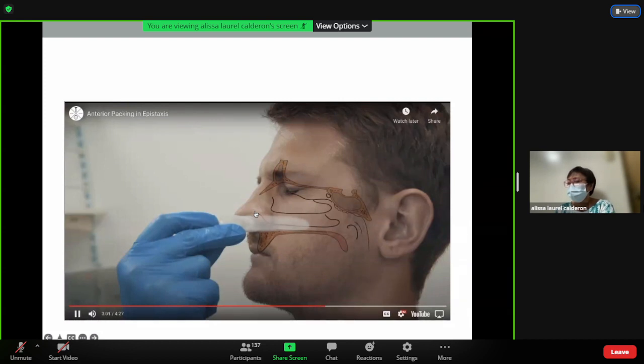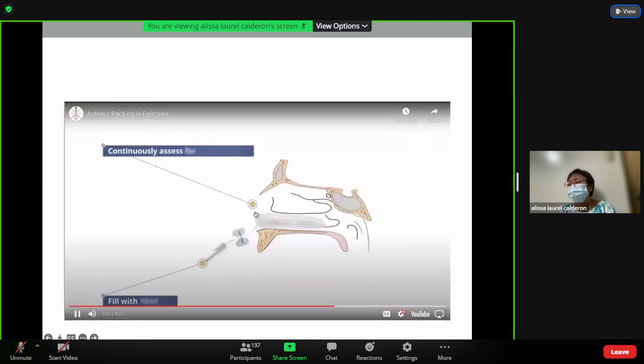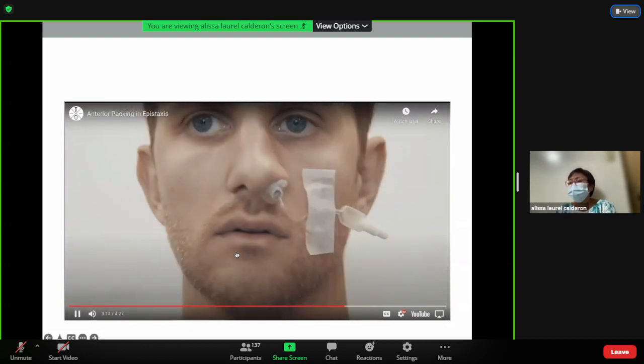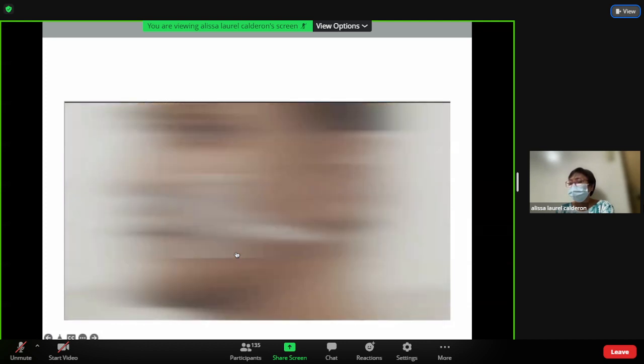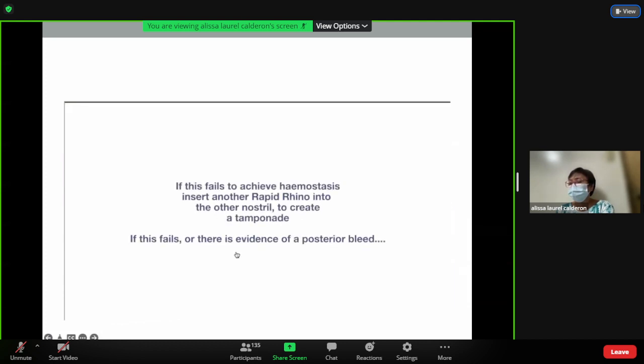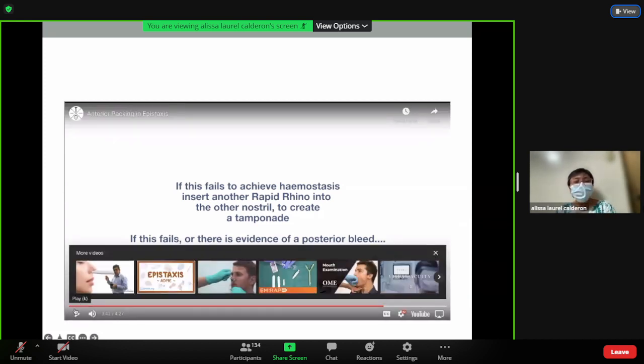Insert the pack, keeping as close to the floor of the nose as you can. Slowly inflate up to 10 ml of air, reassessing hemostasis. Tubing from the Rapid Rhino should be taped to the patient's cheek, as shown. Post-pack care is important. You might also consider placing a nasal bolster to cover the nostrils. If this is unsuccessful, repeat the process with the other nostril to tamponade the septum. If the packs fail to achieve hemostasis and blood continues to trickle down the back of the throat, or if it's clinically evident that there is a posteriorly situated bleeding point, then you will need to discuss management options. We won't discuss that any more. That's very technical.